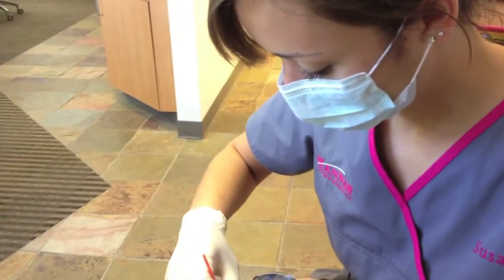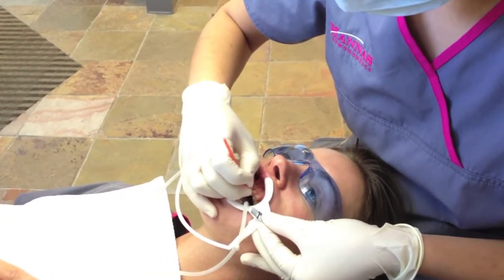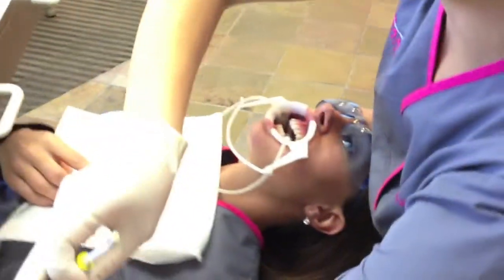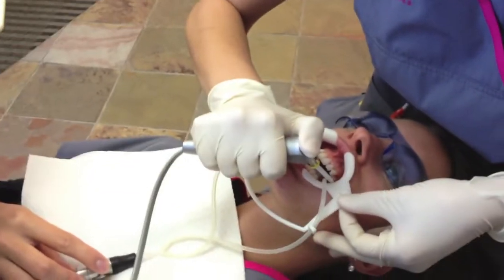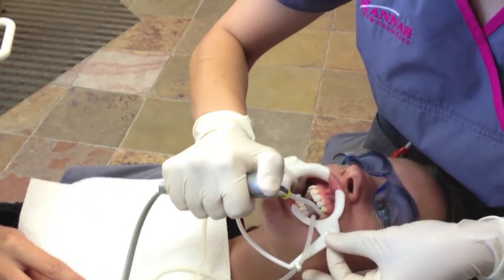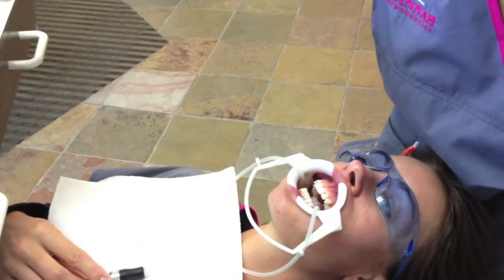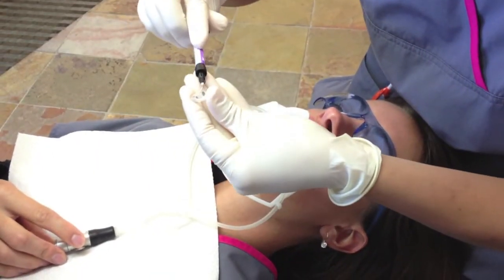Since the brackets and the trays are segmented, we're just gonna do a little bit at a time. We're gonna do our back molars on the left side first. A little bit of air drying up some of this.